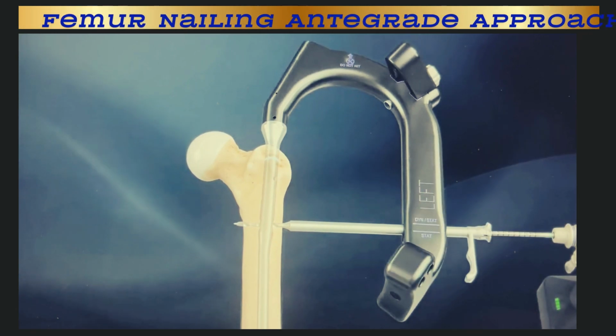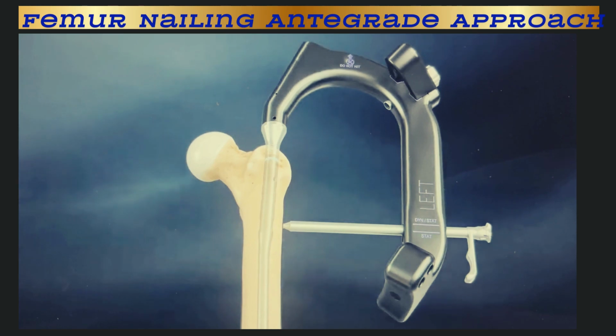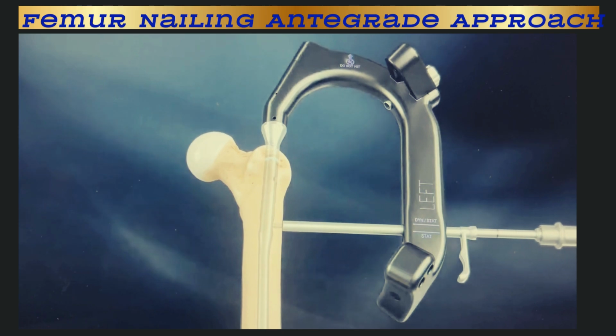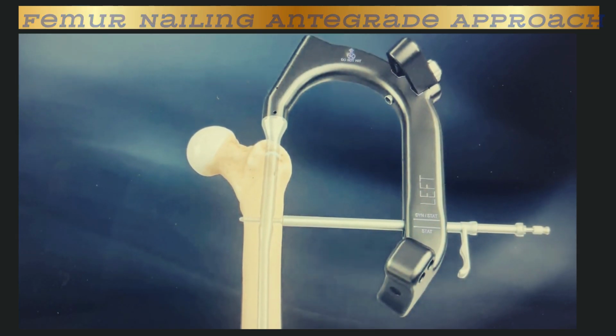Remove the drill and drill guide and place the screw directly through the sheath using the captured hex driver system. Insert the screw until the black laser edge line is at the level of the screw sheath. Verify screw positioning using fluoroscopy.